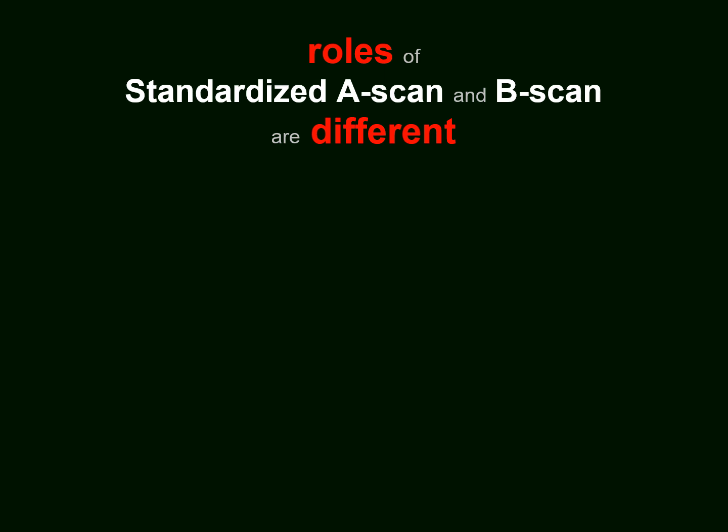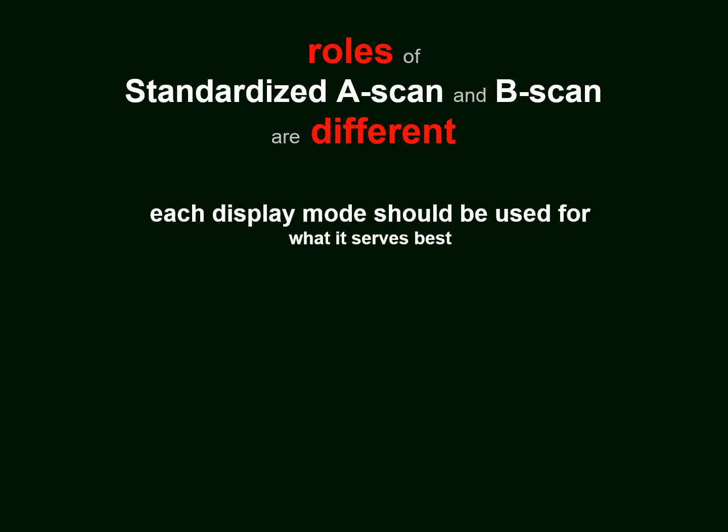But both A-scan and B-scan should be used in combination. They have different roles, and therefore each modality should be used for what it serves best.